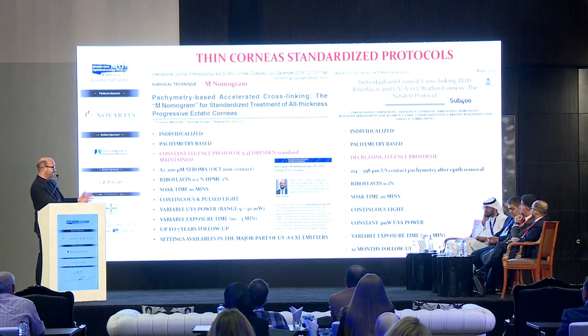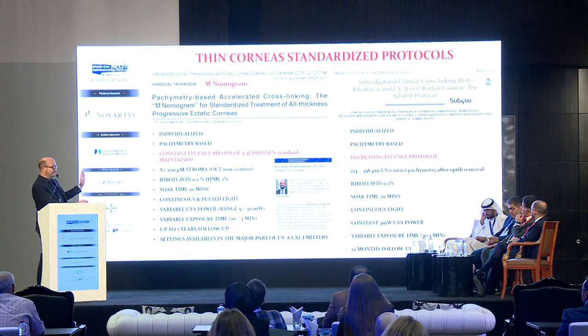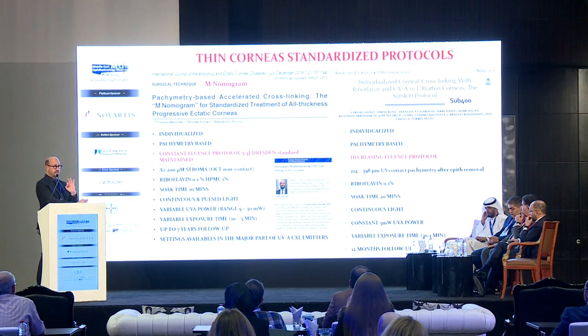What is the difference? Both are pachymetry-guided protocols, but the M protocol gives always 5.4 joule of fluence. So it maintains the fluence constant independently of the thickness.